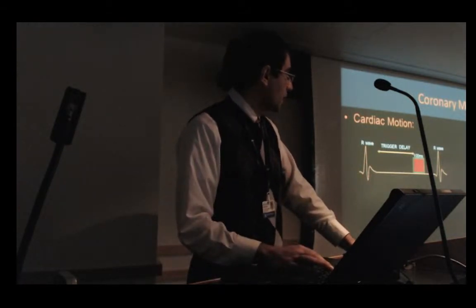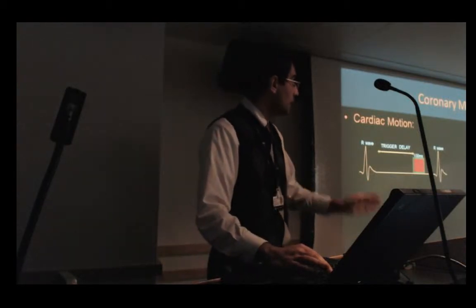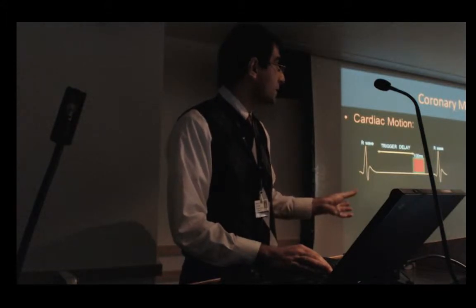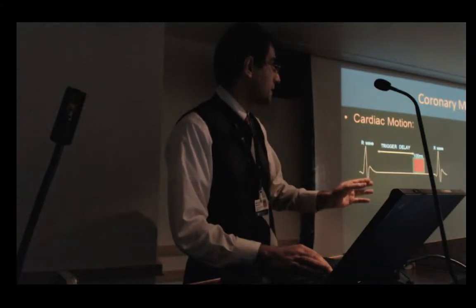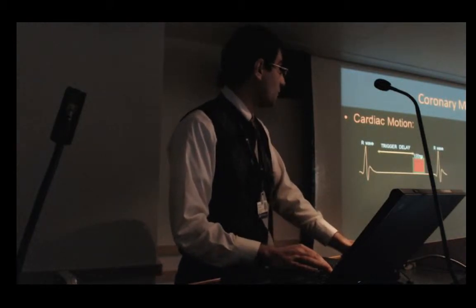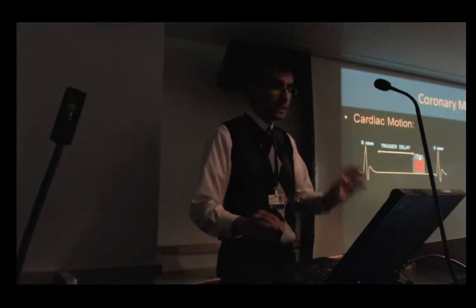Here I'll show you the time where the heart is very still to detect coronary artery disease. You can see the cross-section of the coronary artery is here, and you can see it doesn't move at mid-diastole. So we have a very certain period of time, between 80 milliseconds to 120 milliseconds, to image. That means that for each cardiac cycle, I have only 100 milliseconds to fill up my k-space data.